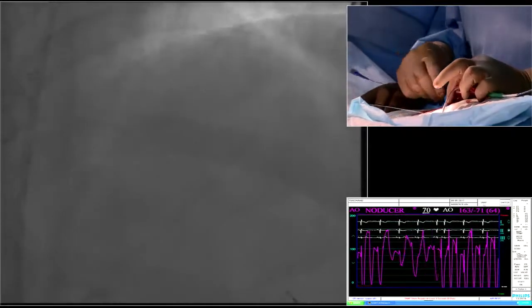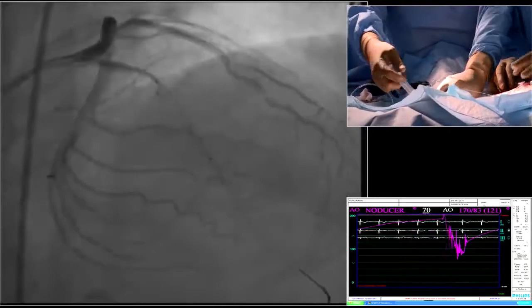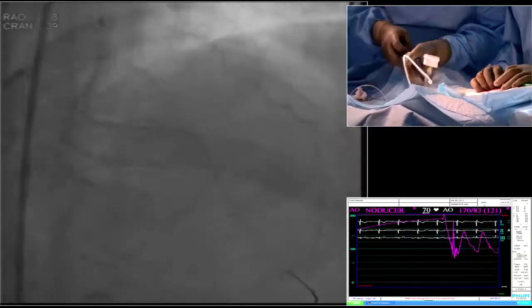Look for a 3.0 NC Mosaic. Okay. Let's say little dye. Good. I think we are good. That's what we wanted. So go slow.